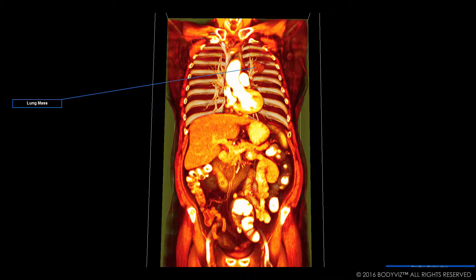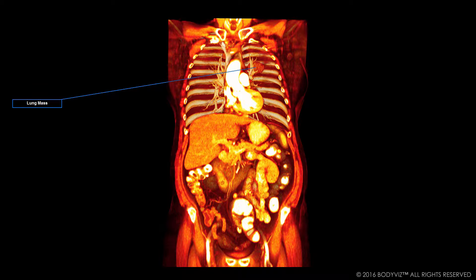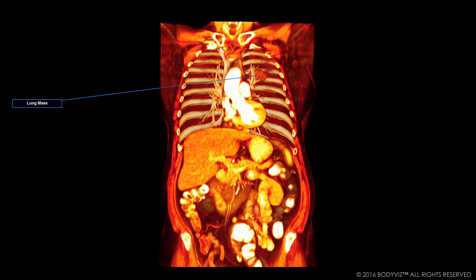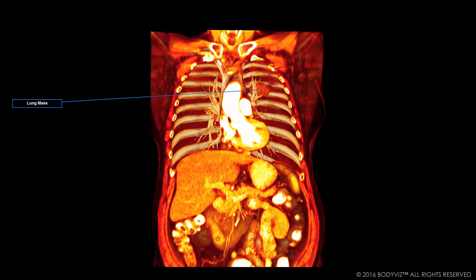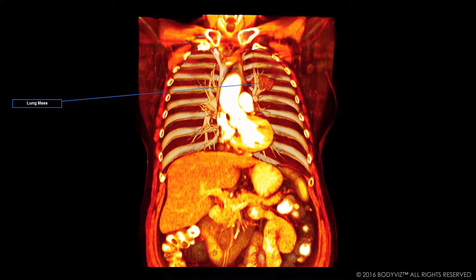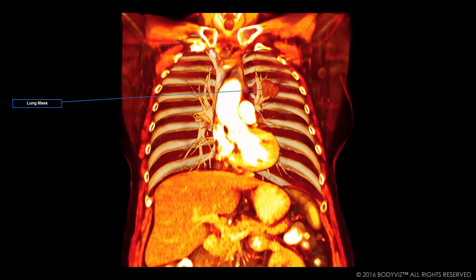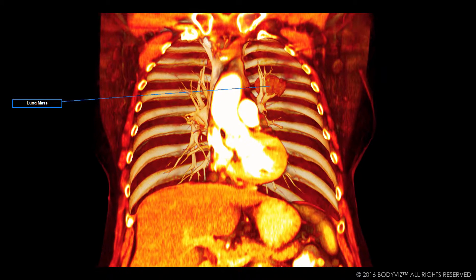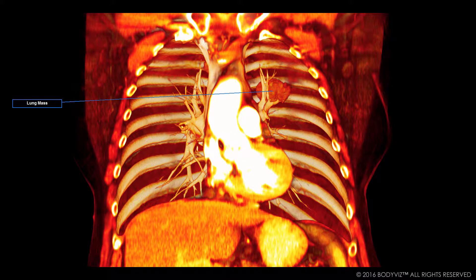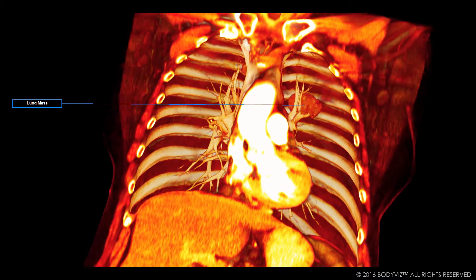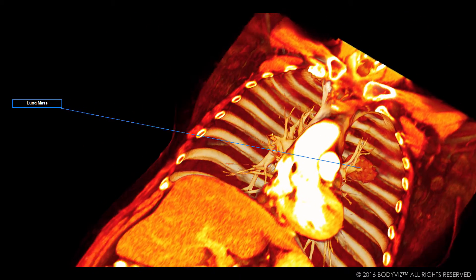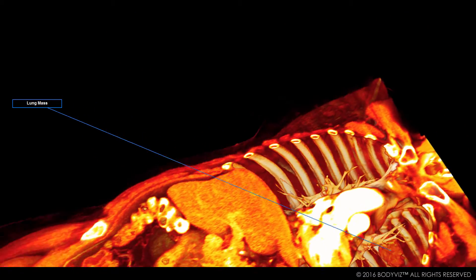Now we're getting a view that's close to what you saw on Facebook. This is a 53-year-old female patient from the BodyViz library. Most importantly, this is real patient data that we're seeing. BodyViz renders MRI and CT data directly into 3D visualizations.